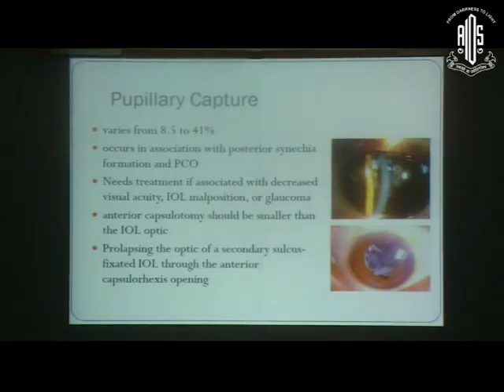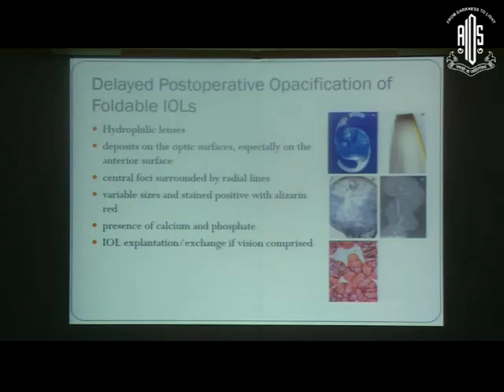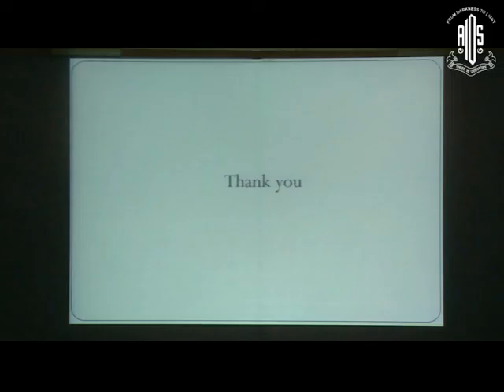Pupillary capture is again very common. In very severe cases, it may warrant IOL exchange. Deposits on the IOL, fortunately, is not visually significant in most cases and can be left behind. Delayed opacification is seen only in hydrophilic lenses, and fortunately, with the use of hydrophobic lenses in children, this complication is on the wane. Thank you.